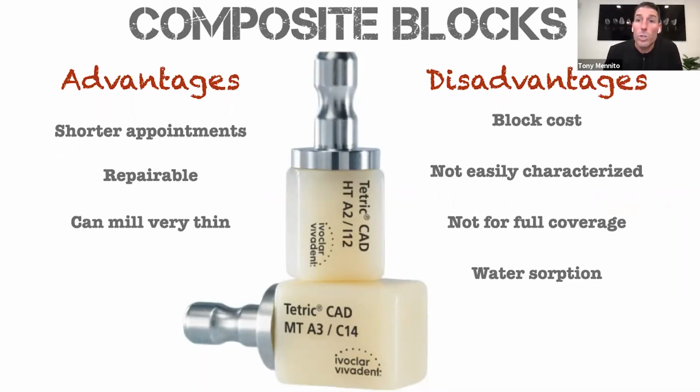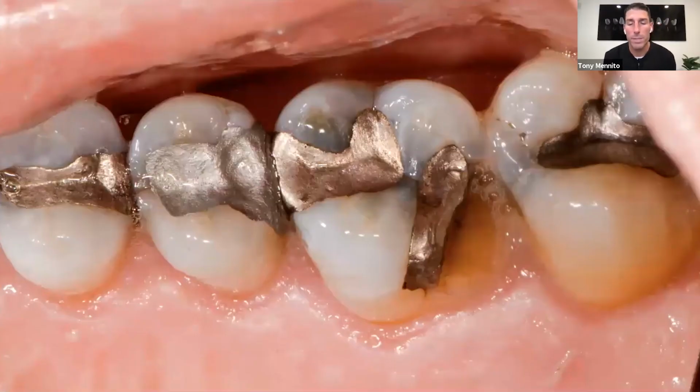And the other thing is water absorption. Composites are known for their propensity to absorb moisture from the oral cavity, and these materials are no different. What is sort of being discovered now about these materials is that the strength of them is pretty good early on in their lifetime, but as they absorb some of this moisture, that strength can decrease kind of slowly over time due to that water absorption. And the same is true for direct composites. So that is one negative of this material.